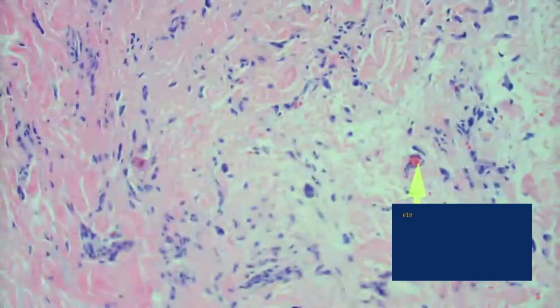What if I told you it was a cluster of brown dome-shaped papules on the leg of a middle-aged woman, asymptomatic, been there for maybe several months. She was perfectly healthy, no breast cancer, no ovarian cancer, nothing else. Well, there's a thing called multinucleate cell angiohistiocytoma. Okay, because it kind of looks like a histiocytoma in a way. It's got DF-like collagen, and it's usually fairly well circumscribed in the dermis. And that's what this is.